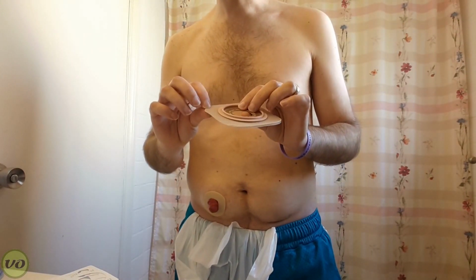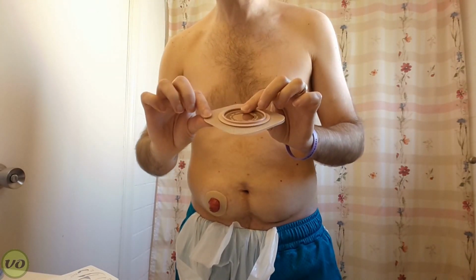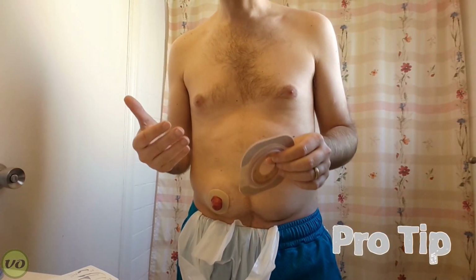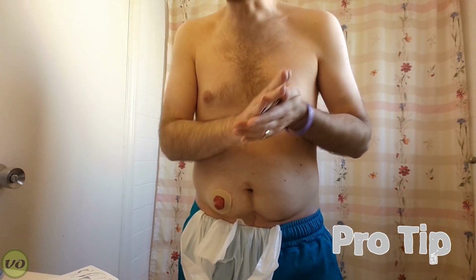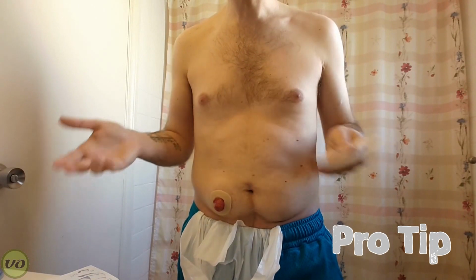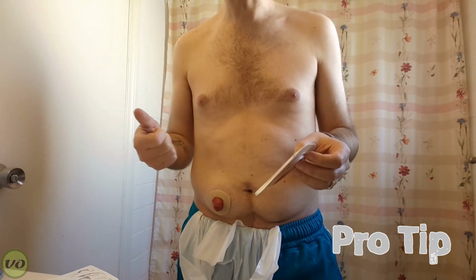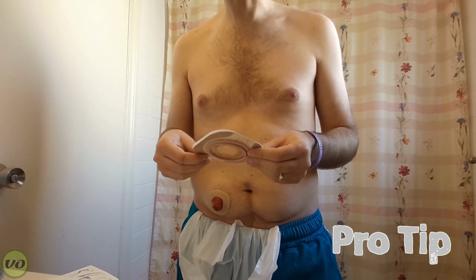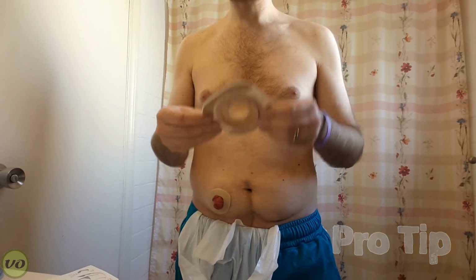However, if you are using a wafer that doesn't have a tape border, but has that hydrocolloid going right out to the edge, a lot of the time you do want to preheat that. So some people will just put it under their armpit, some people will just rub it until it's warm. It's really up to you. Some people will use a blow dryer or a hair dryer on a warm setting, whatever gets the job done. But those adhesives tend to work better when they're slightly warm.